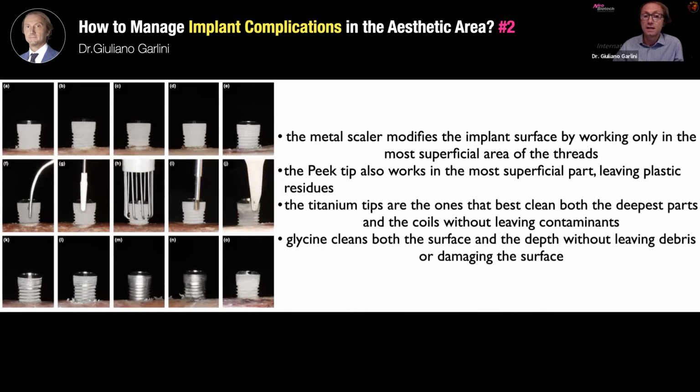detoxify the implant surface. For example, the authors analyzed that metal scalers can modify the implant surface and that they can work only in the most superficial area of the threads. They saw that the PEEK tips that work with ultrasonic and with irrigation leave plastic residues around the implant.